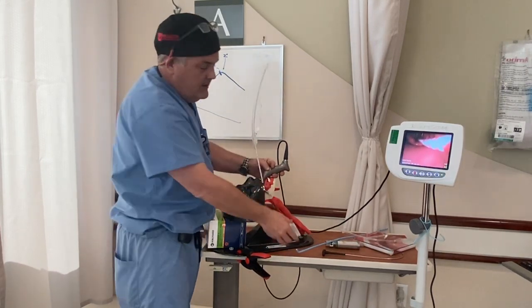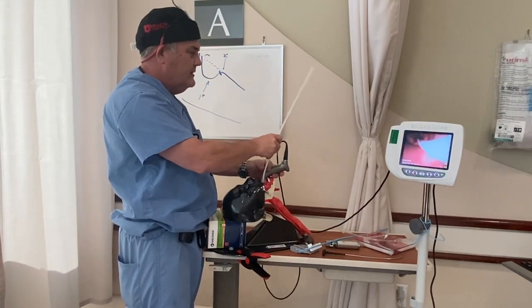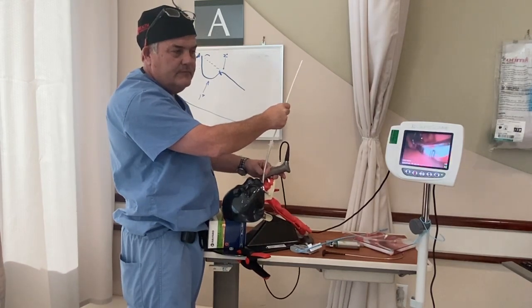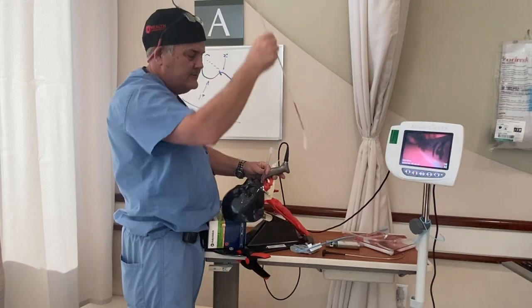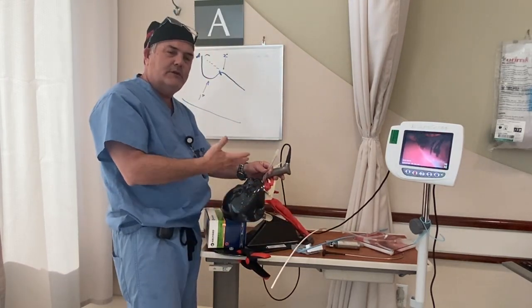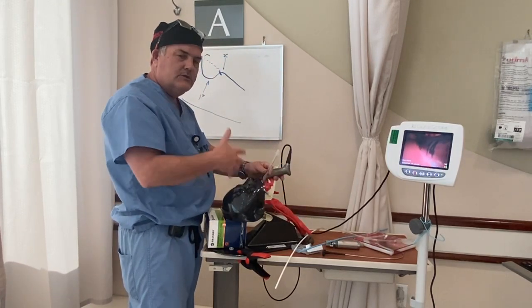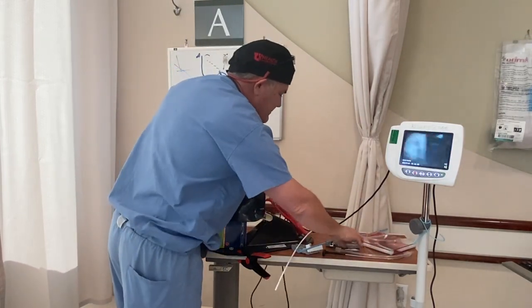The handle pops off and the tube is railroaded in. The trachea in this model moves around when force is applied anywhere — in a real patient it would just absorb that force. That's the full sequence. I'll go over it one more time.